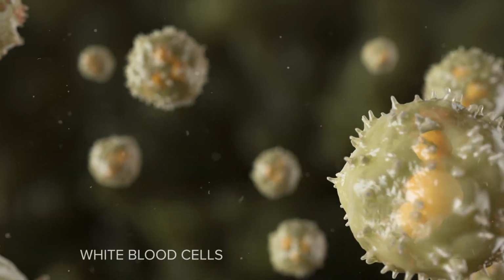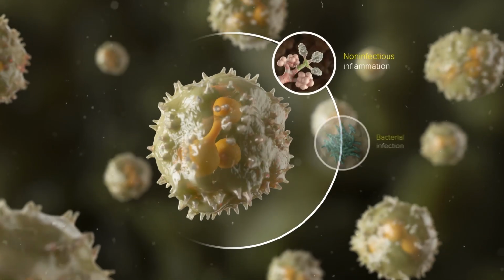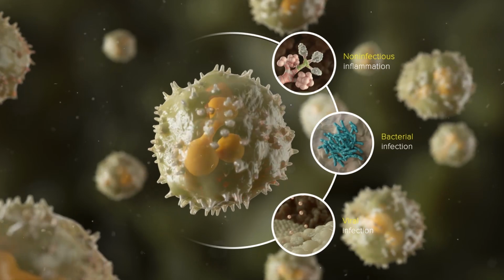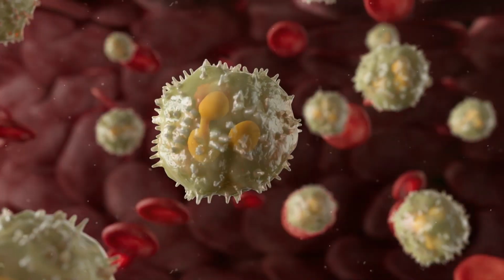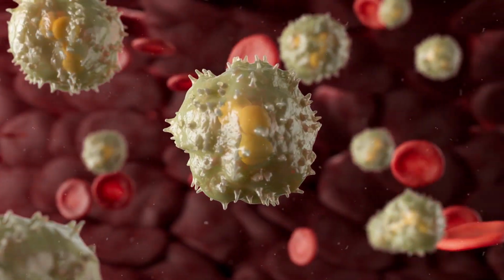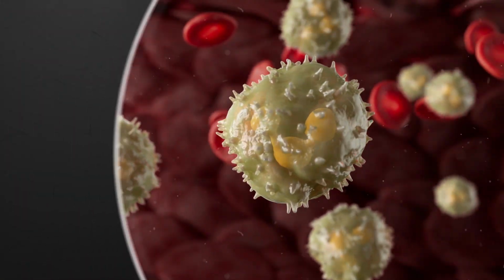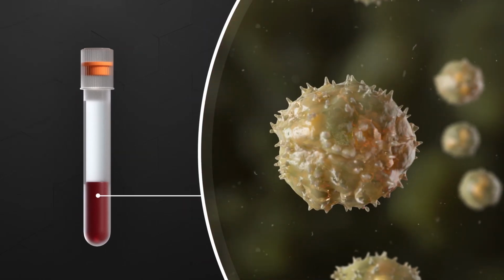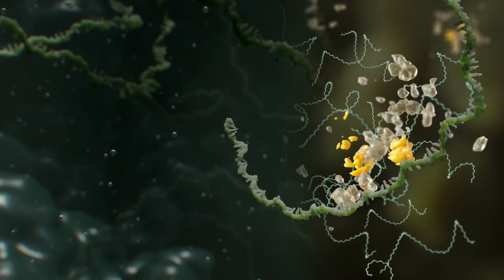A local infection causes a local inflammatory response involving white blood cells and other immune cells. This immune response differs depending on whether the insult is non-infectious, bacterial, or viral. Ultimately, the activated immune cells enter the circulation and can be detected in the blood. From a blood sample, we can measure the immune response by reading the gene expression profiles of these circulating cells.